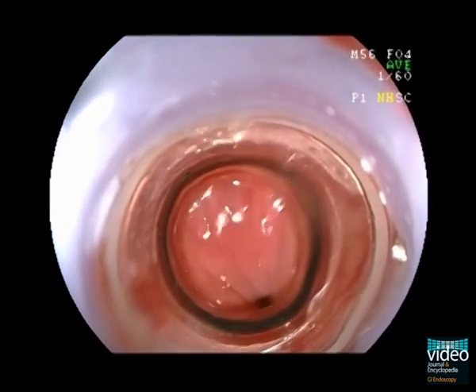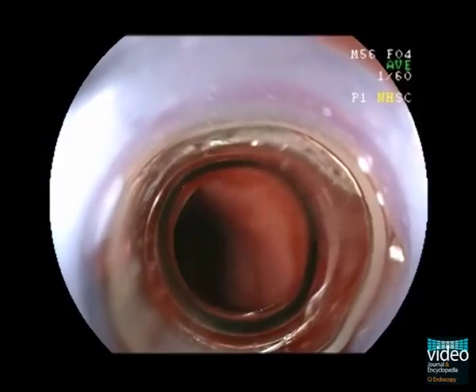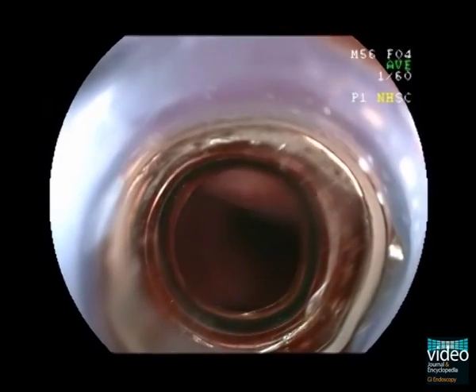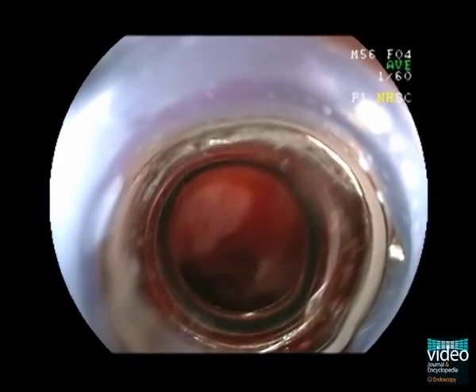During the endoscopic examination, carefully locate the possible bleeder. No active bleeder is initially observed. Gently flush with water to remove blood clots and to obtain a clear endoscopic field.